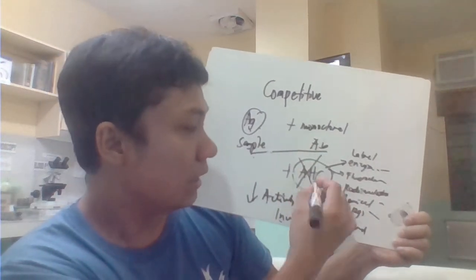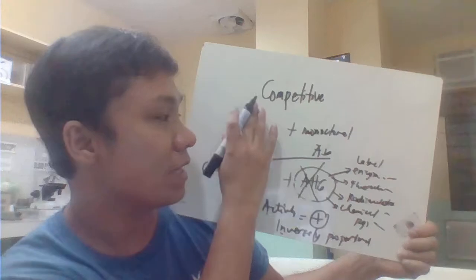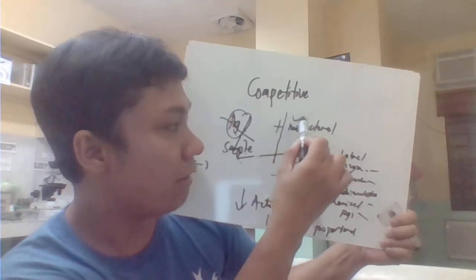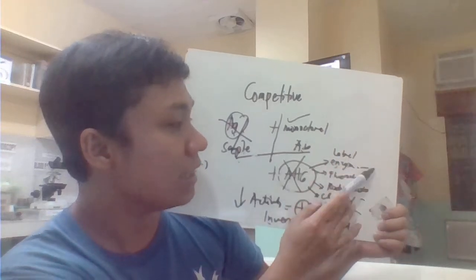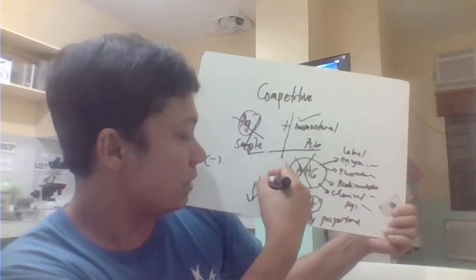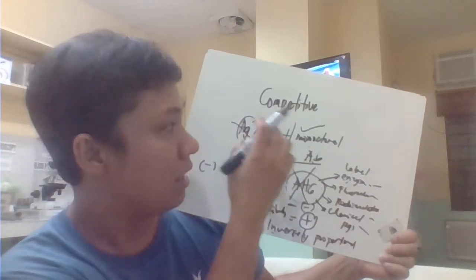Okay, pag increase activity naman, like for example, pag negative ang result natin. So, pag negative ang result, your sample here wala siyang antigen. What you have here, your monoclonal antibodies or agent, ay magiging free, di ba? Pag free ito, magbabind dito. So pag nag-bind dito, it would have an increased activity. Ito ang measure natin. Increased activity kasi nag-bind siya. Pag increased activity, we consider that one as negative. Increased activity ito kasi wala kang antigen. That's competitive.